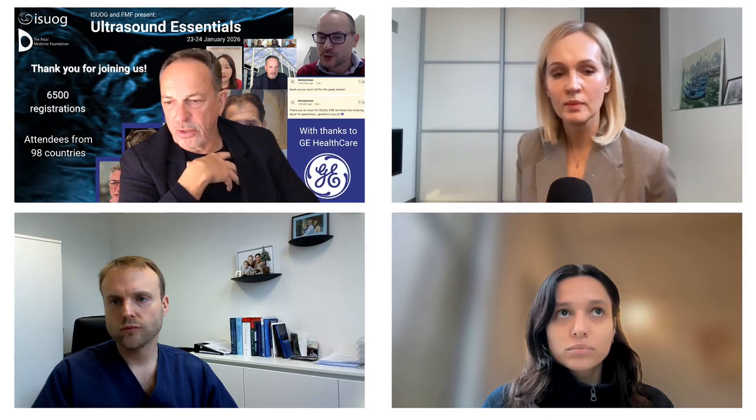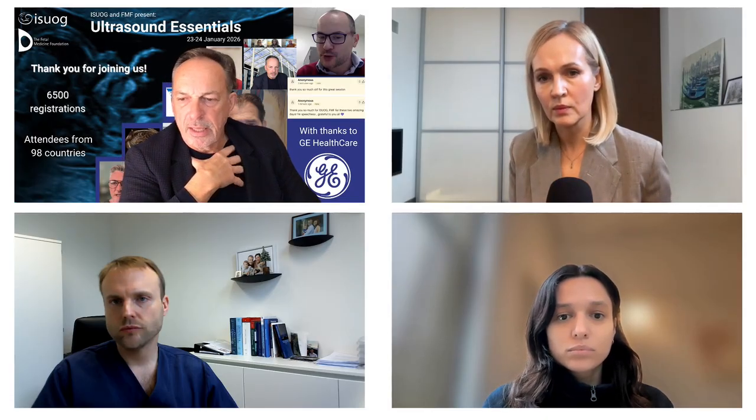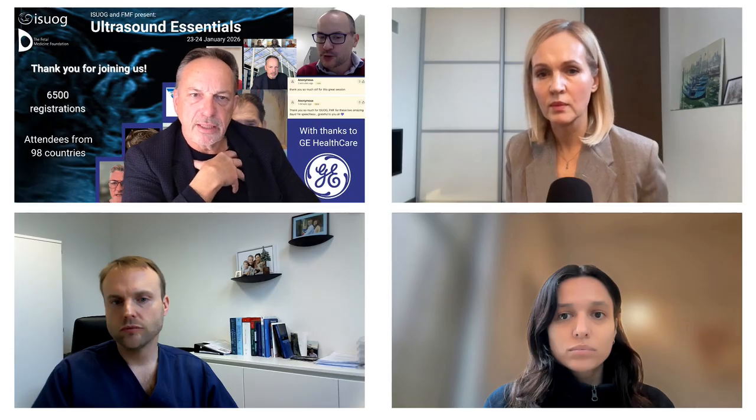So direct answer to the question is, unless Dirk, do you want to chip in here? You might have something to say. It's available on some ultrasound machines at the moment still, but unfortunately our online free calculator is no longer available for the reasons I've just said. Do you want to add anything to that, Dirk?